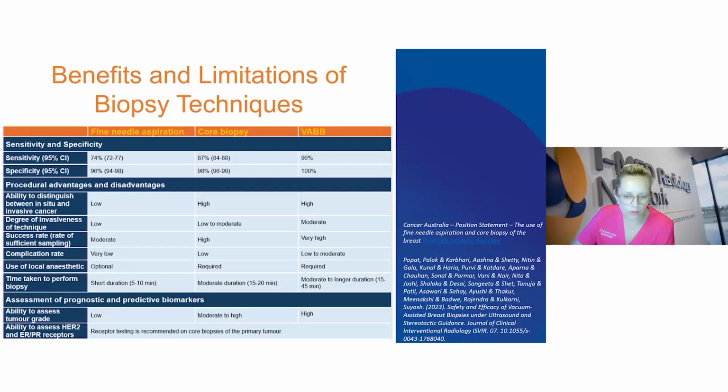They are bigger cores. The complication rates are slightly higher because we have vacuuming tissue into our aperture, and we can get vessels and cause bleeds in those circumstances, but we are watching under imaging. So we do know when that's happening, and we can act in the moment to minimize the complication. We do obviously have to allow for more time, and that's generally the setup.